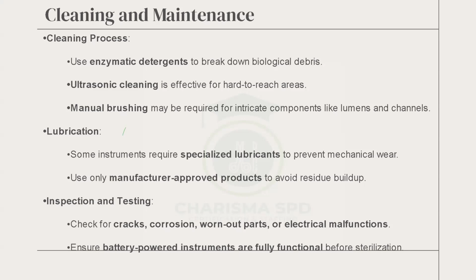But you'll have to lubricate it, check for cracks, just as we do for simple, basic instruments. Lubricate them when you detect that certain parts of them are becoming too difficult to function. Any question before we get to the next slide? All right, next slide, Director.